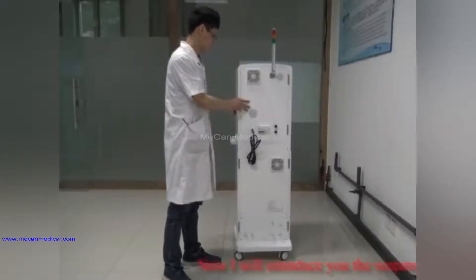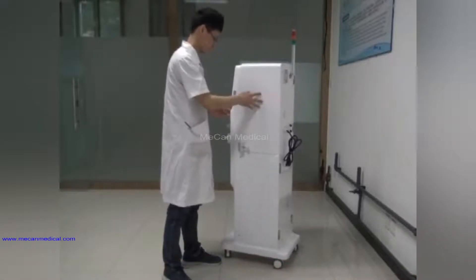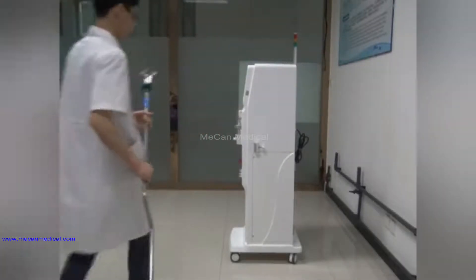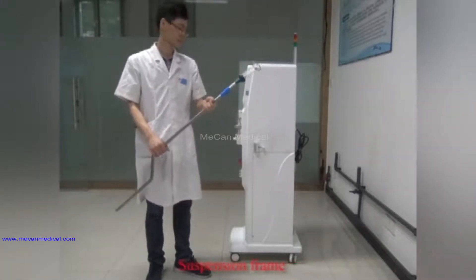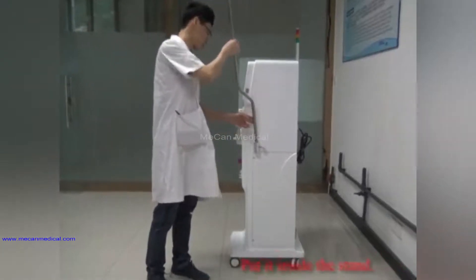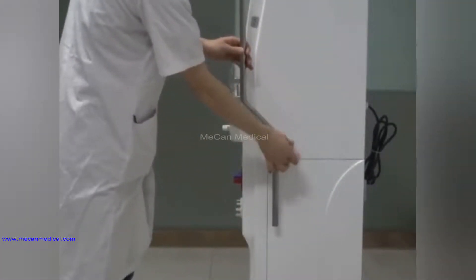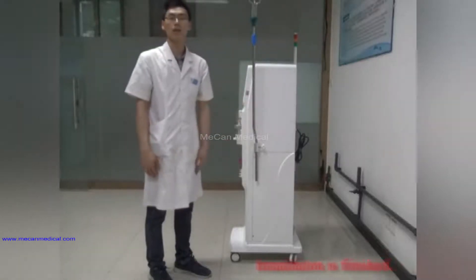Now I will introduce you the suspension frame. Put it inside the stand. Installation is finished.